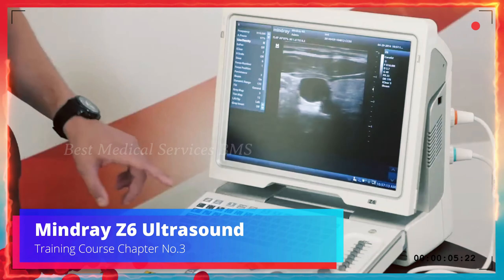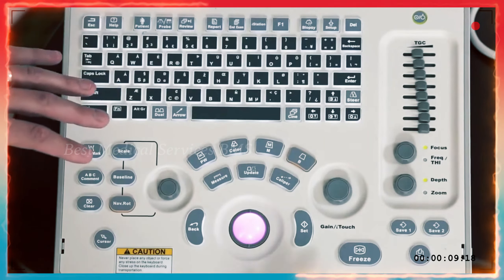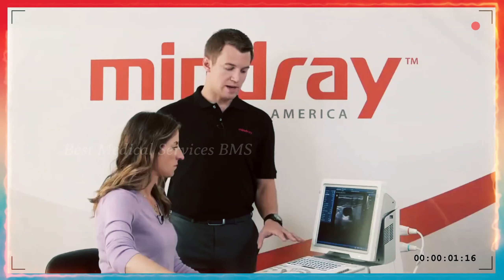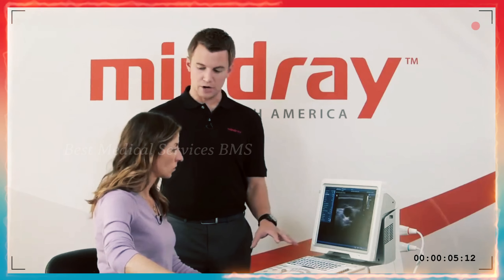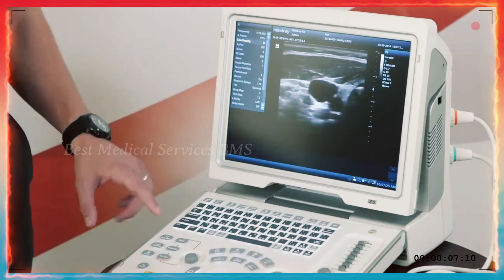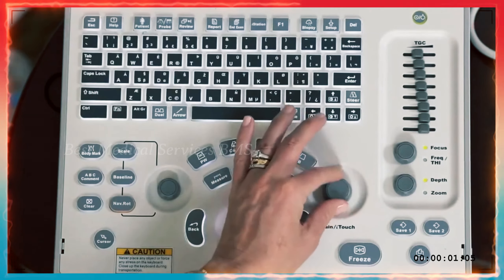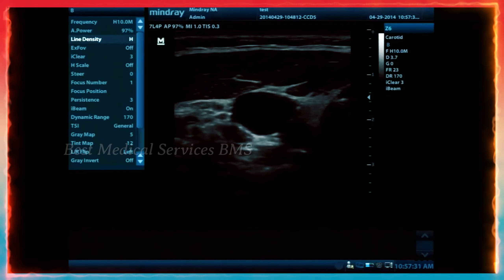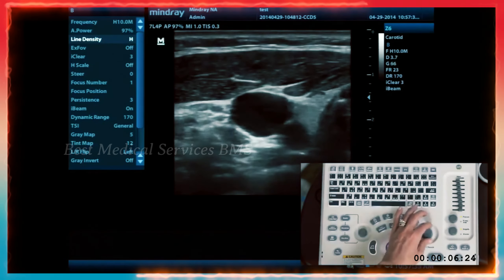Now that the machine is on and you've selected your patient information, probe, and exam preset, we're going to talk about how to optimize the image. As you put down the transducer and see whether it's too bright or too dark, look for the gain knob. As you turn it counterclockwise it becomes darker, and when you turn it clockwise it becomes brighter. That knob also says iTouch — when you press it down, iTouch appears in the top right corner list as an auto-optimize feature.